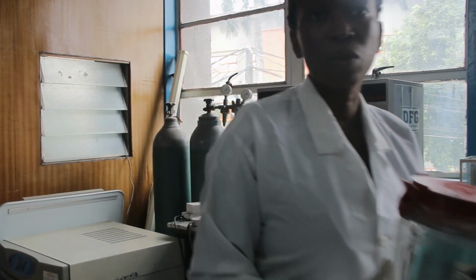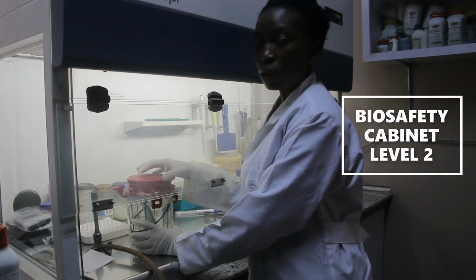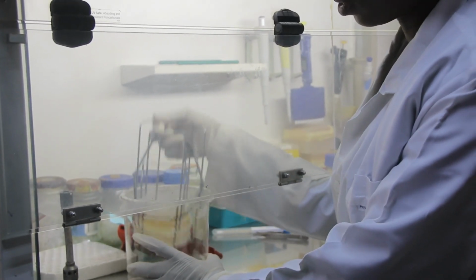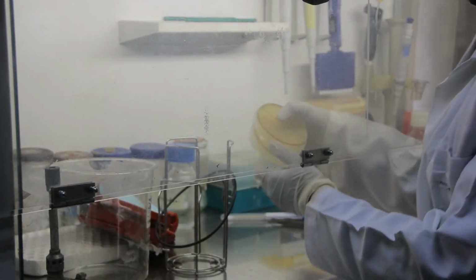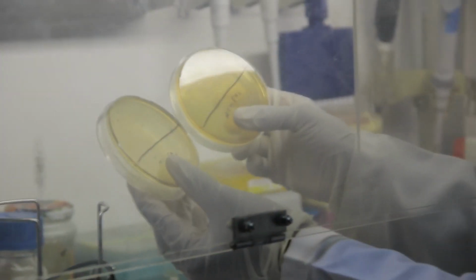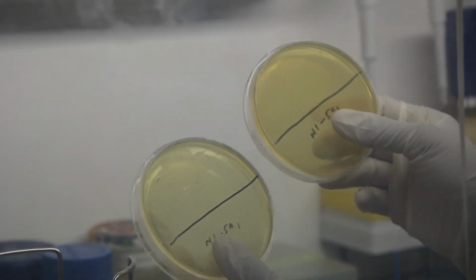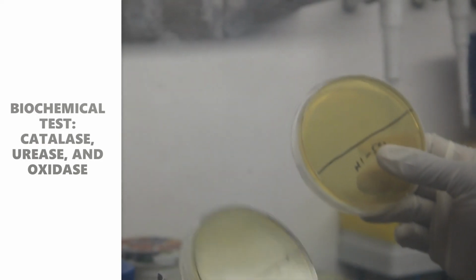This inspection will be done under a biosafety cabinet level 2. The plate will be removed from the gas jar to examine for H. pylori growth. Okay, so we have visible growth of H. pylori, which are tiny translucent colonies, and they can be confirmed using catalase, urease, and oxidase biochemical tests.